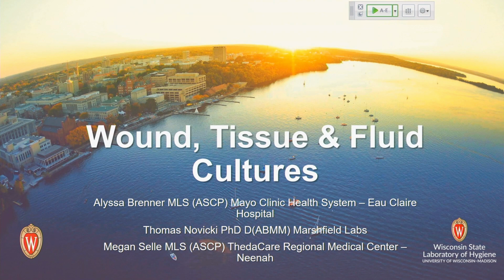And we've also found that by pooling them, because of the decontamination procedures we put these through, often it gets concentrated. So you're even more likely to pick it up by stains or culture methods than if you were doing single samples, separate cultures for each individual one. So our procedure is to automatically pool. We get 3 or more from the same surgical site.